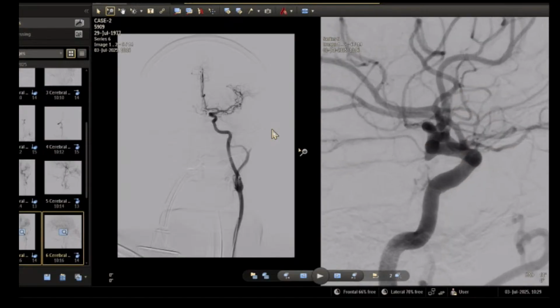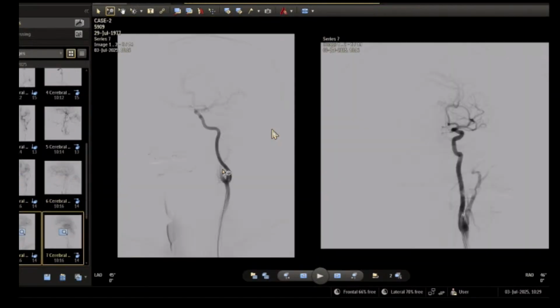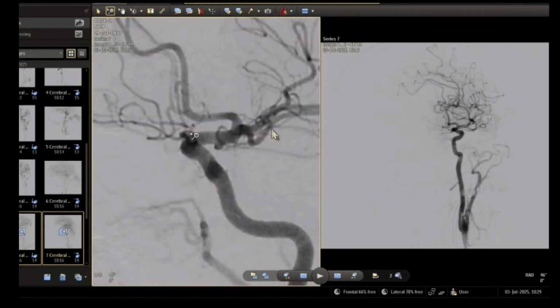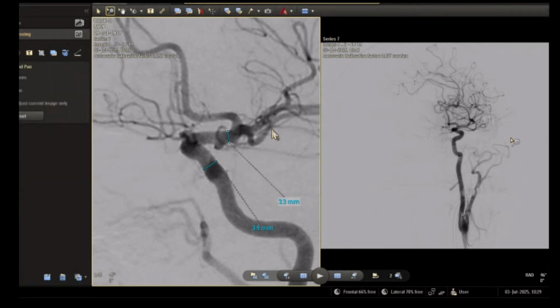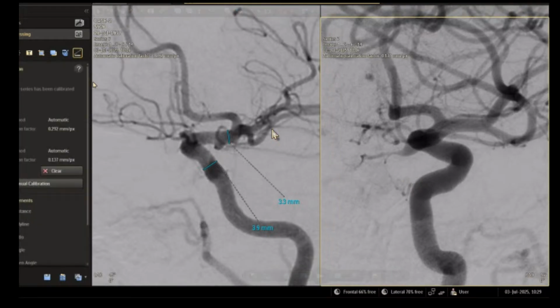It's also discussable to follow this segment until the aneurysm grows or not, but we will respect the patient's fear and concern about this segment, and we will place an FD stent for the ophthalmic microaneurysm.